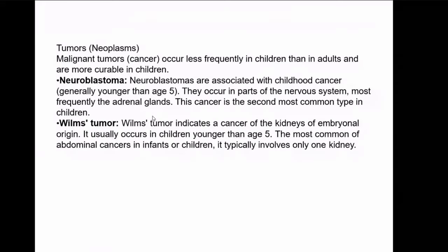And next is the Wilms tumor. Wilms tumor is a cancer of the kidney of congenital origin. We can use the AP view or we can use the gastrointestinal series. That is, we can do the barium studies or endoscopy.